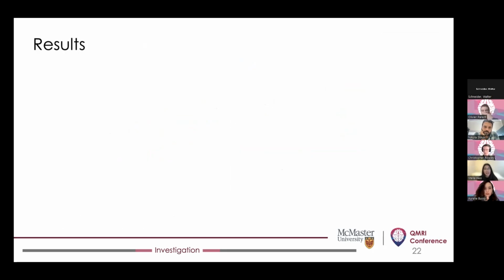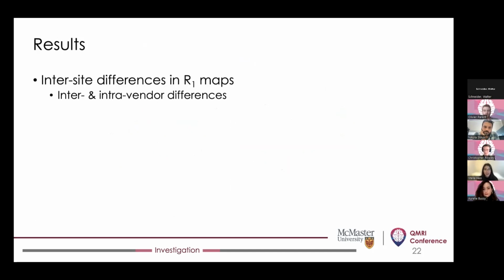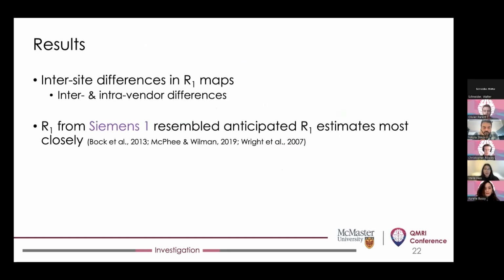So just to summarize our results so far, we saw that the intersite differences in R1 maps still remain even after we incorporate the B1 plus field maps in computation. And because R1s from the Siemens site most closely resembled the values we saw in past literature, we started wondering about why the GE sites may be recording higher R1 values than expected. And one hypothesis that we came up with was that different intensity scalings or gain factors may have been applied to the two T1 weighted images without our knowledge at the GE sites.